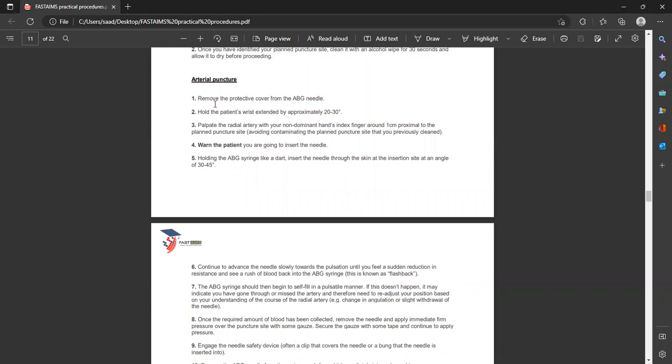Now, in the video part, you will see that they palpate and then they prick blindly. In real clinical settings it is difficult. You can put your two fingers and then go between your two fingers, like we do in our clinical settings. That is also acceptable, but do not touch the area which you have cleaned with the swab, because you have to take care of sterility.